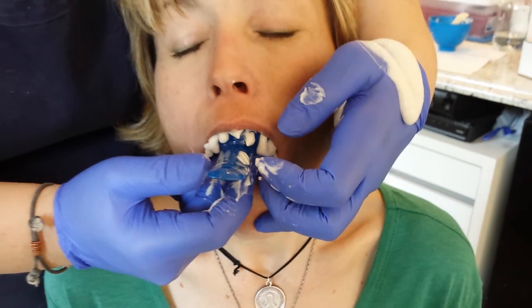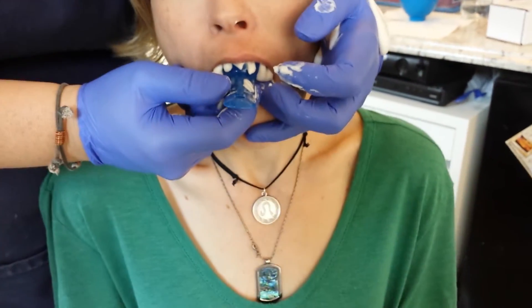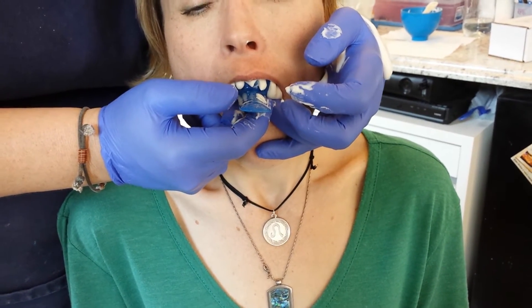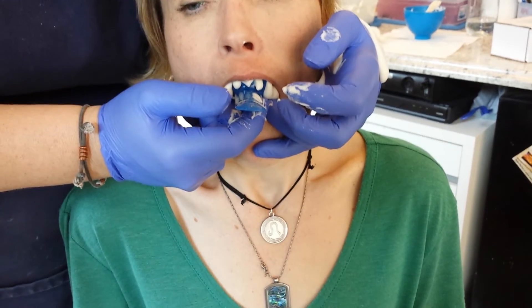Ask the patient to tip their head down so that the material doesn't flow to the back, and have them breathe through their mouth or their nose, whichever is most comfortable for them.